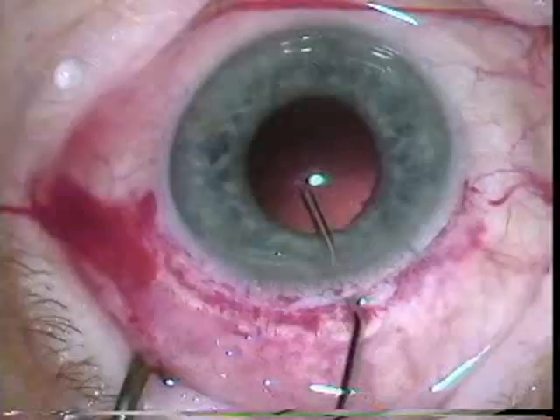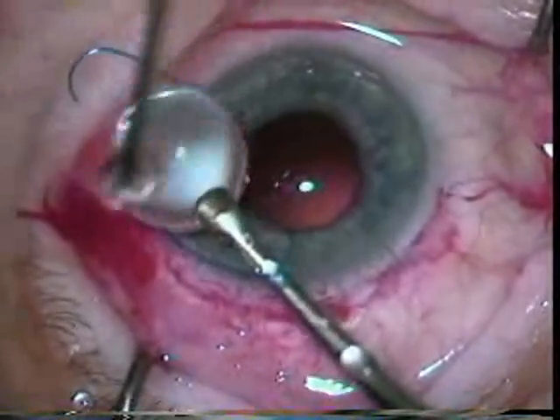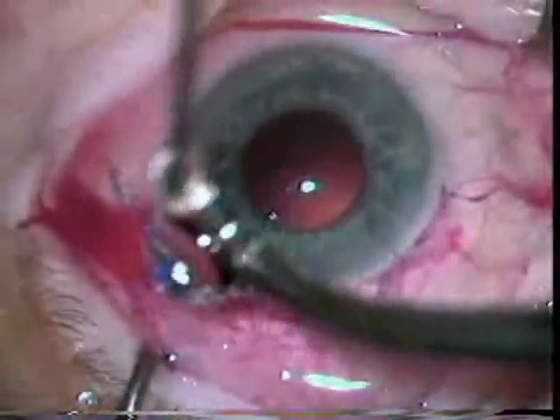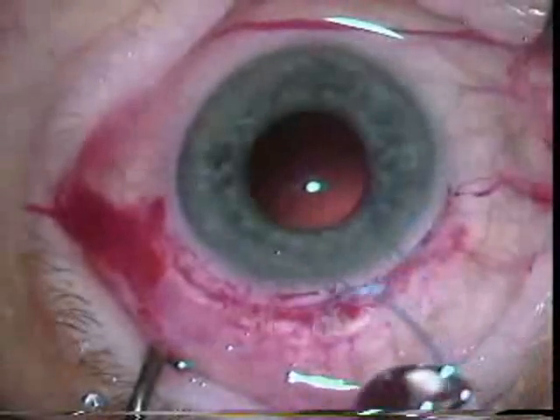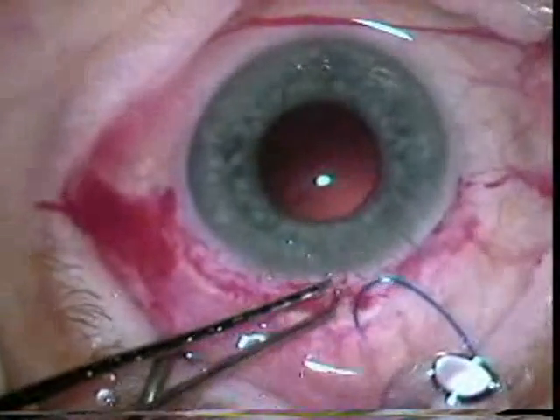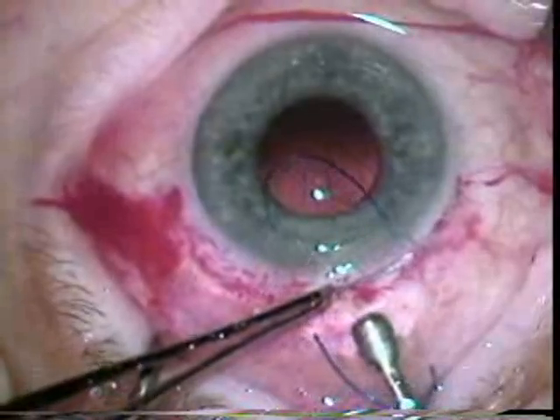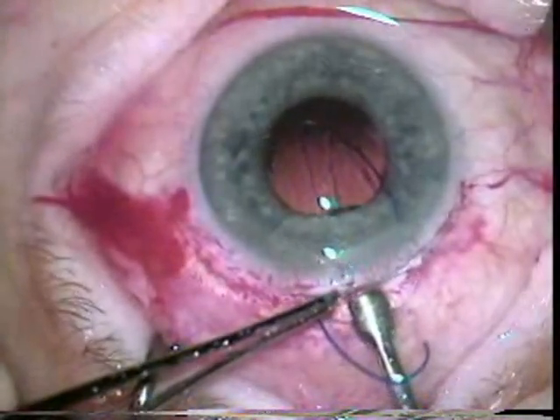This is an SK-21 lens, which is an interesting PMMA lens that Dr. Kolder liked, with haptics made of prolene. I still see a lot of patients that have had this lens placed who are very happy with nicely centered lenses.